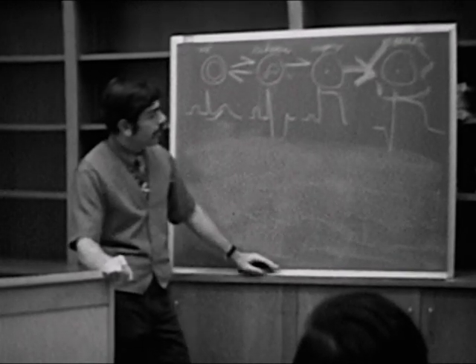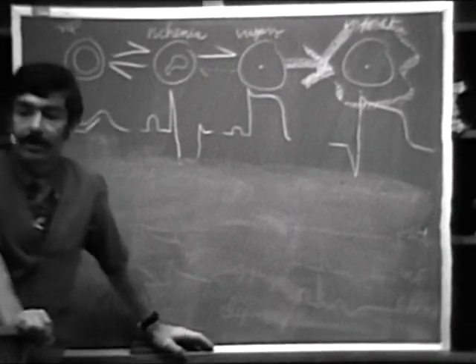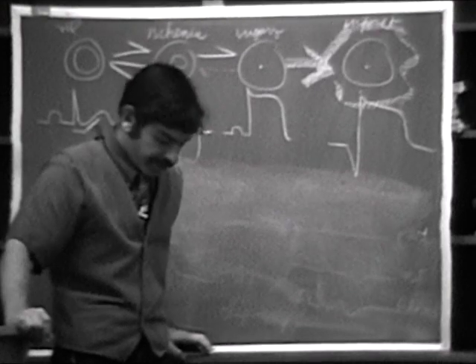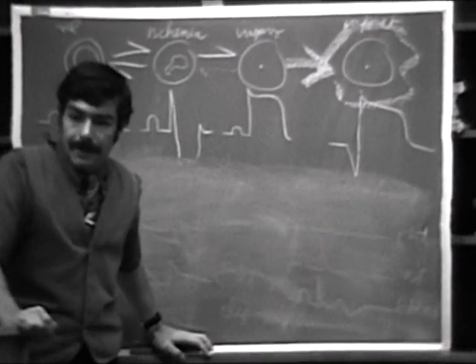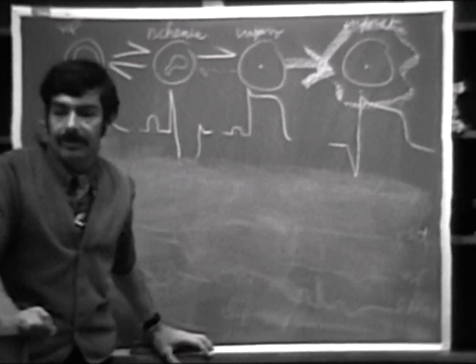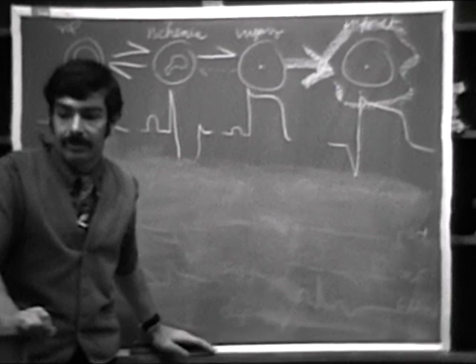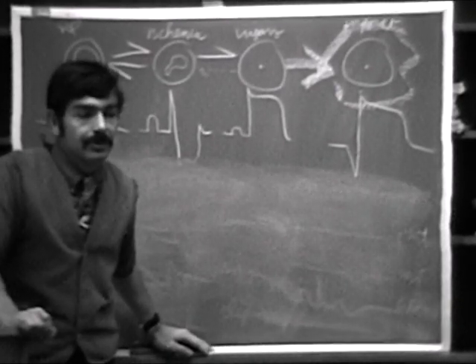All right, and what other situation might you see ST segment elevation in? There's one other situation where you get ST segment elevation. No, changes in potassium levels really don't change the ST segment. They alter the peaking of the T waves and do some other things.